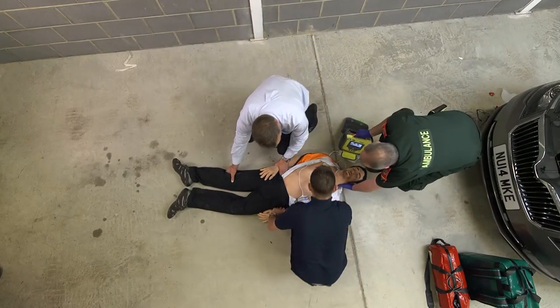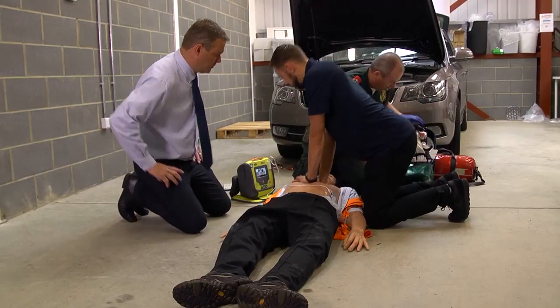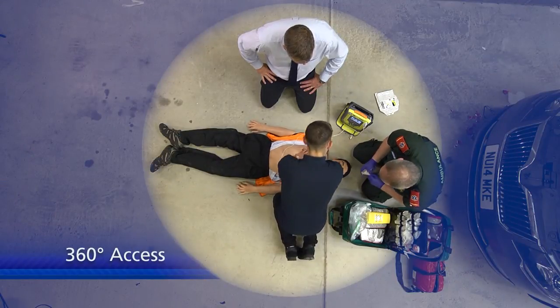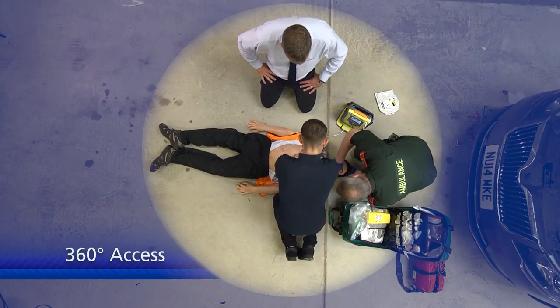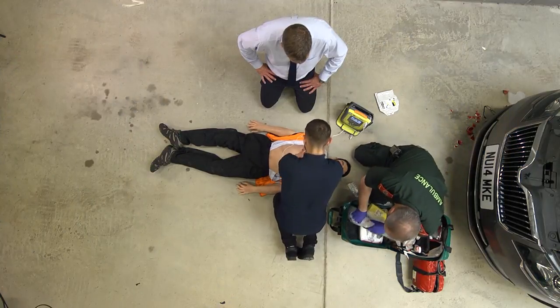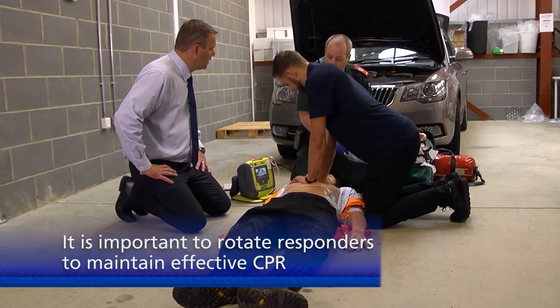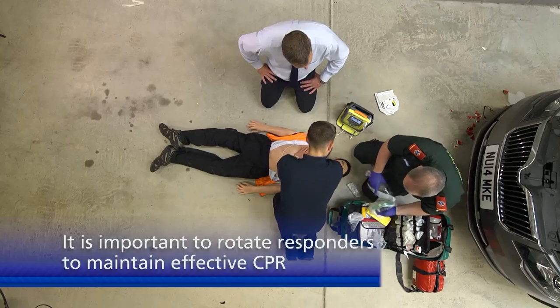Lovely. And if you just keep doing CPR for me, and yeah, you just keep doing chest compressions like that, that's excellent. It's important that ambulance staff create a clear zone called 360-degree access to allow safe and effective working. Push harder. Okay, so, Jimmy, once I've got the airway sorted, we're going to swap over. So you're going to take over from Nathan, okay. And then we're going to do 30 compressions to two ventilations.